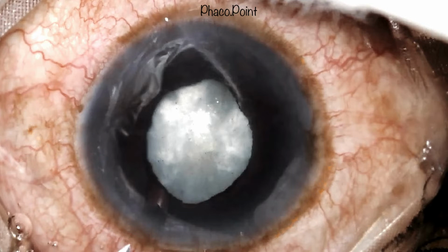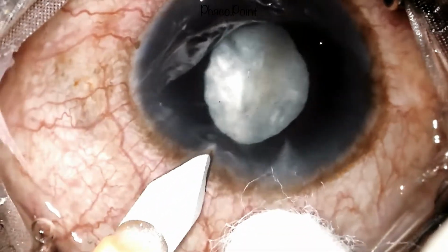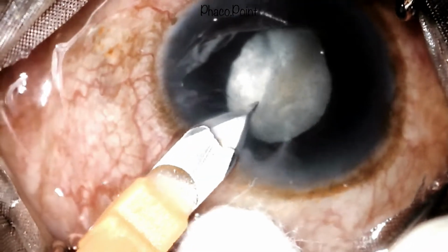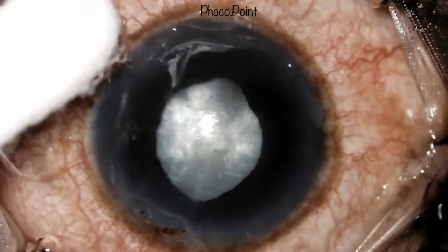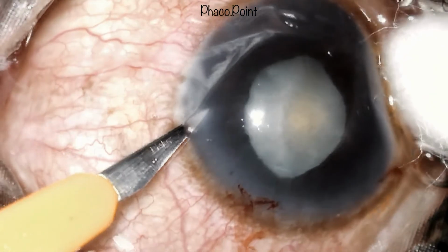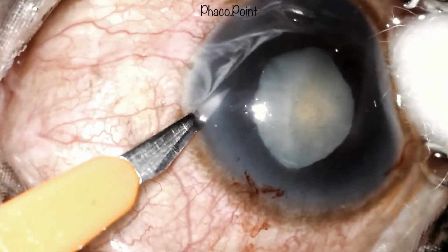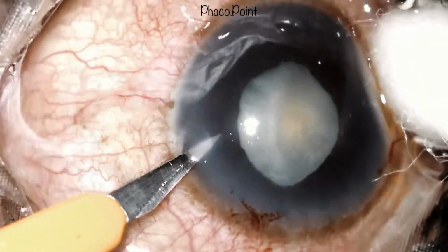We start with making the incisions. Whilst creating the incisions, we need to be mindful of two things. One, the associated corneal edema may make the creation of the incisions slightly difficult because of limited visibility. Equally important is the fact that the peripheral anterior chamber in these cases is rather shallow, so the chances of damaging either the peripheral iris or the corneal endothelium while creating either the 2.8 or the side port incision are significantly high. So we must exert adequate caution whilst doing so.